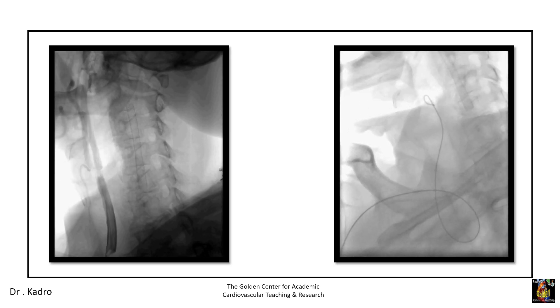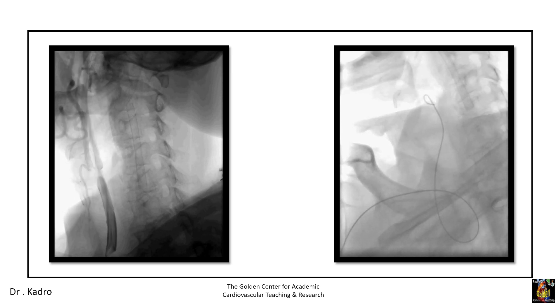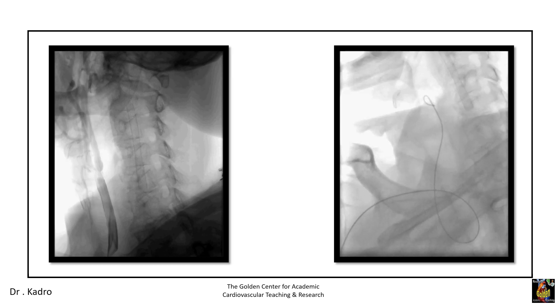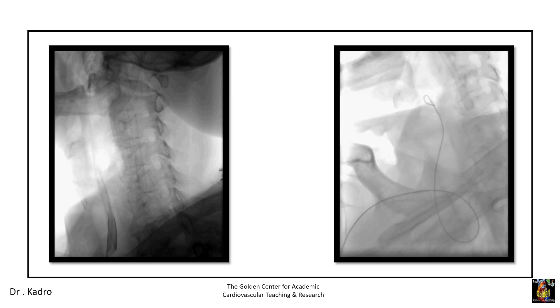This is the angiogram showing severe stenosis of more than 70% in the distal common carotid artery, also affecting the ostium of the right internal carotid artery. You can see the stent in the left carotid system, which was placed a few weeks ago.